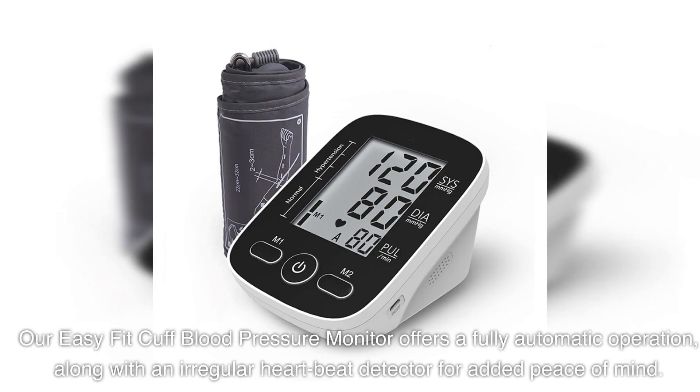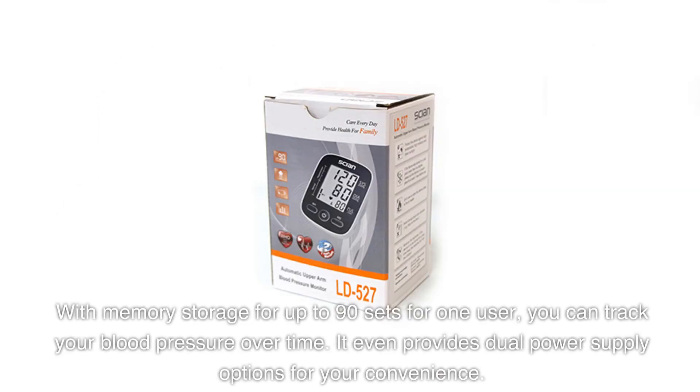Our EasyFit Cuff Blood Pressure Monitor offers fully automatic operation, along with an irregular heartbeat detector for added peace of mind. With memory storage for up to 90 sets for one user, you can track your blood pressure over time. It even provides dual power supply options for your convenience.